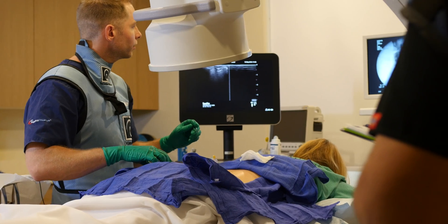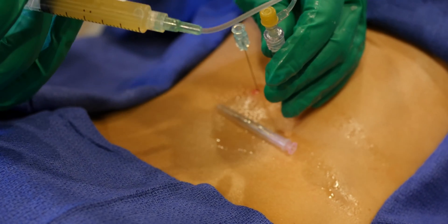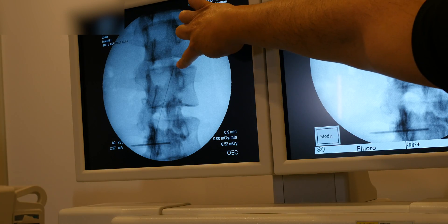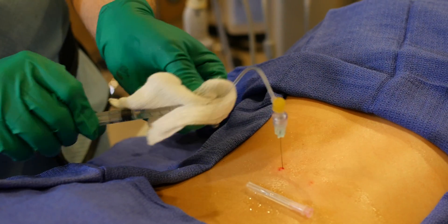Where I'm injecting — do you feel that? Is that recreating some of that back pain? Yeah. So that's in the facet. You can see it leaking around and going in a circle — that means I'm in the actual facet, it's actually in that joint. Yep, so that's confirmed.